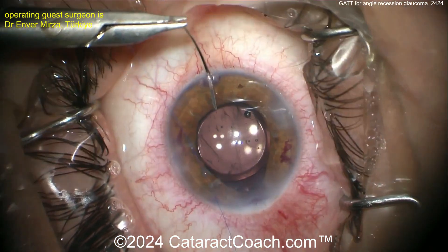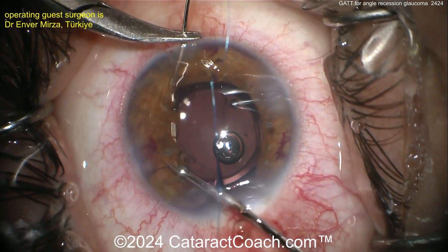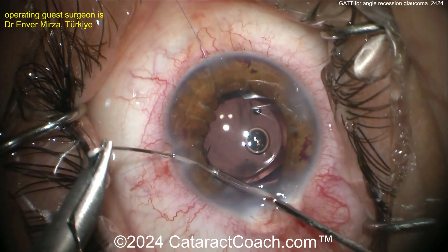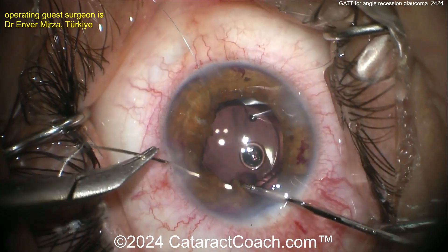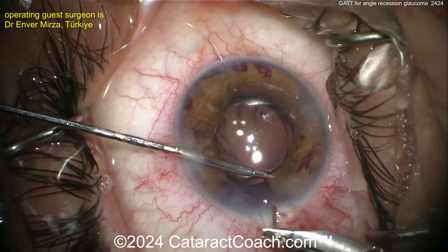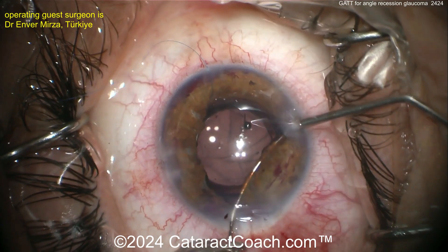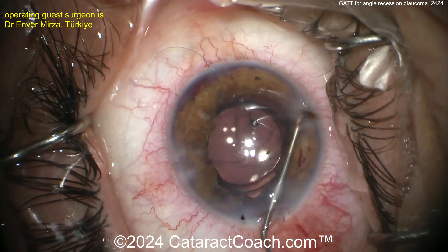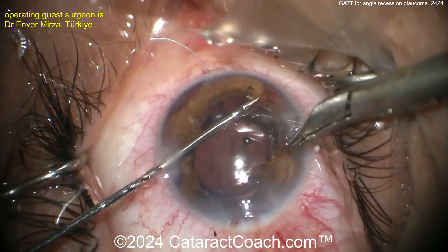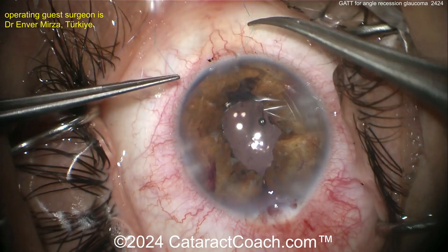It may well be. 10-0 prolene going in — and now, oh, a cerclage suture! What a surprise. I didn't even know we were going to do that. Bringing it outside the eye and going back inside the eye. Cerclage is a difficult suture — this surgeon is fantastic. But remember, for most of us, if you want to bring the pupil down or do pupilloplasty, just try the four-throw pupilloplasty technique — two or three interrupted sutures gives a pretty good outcome.